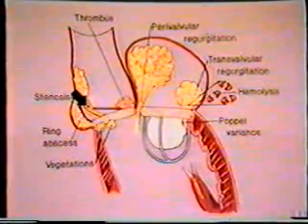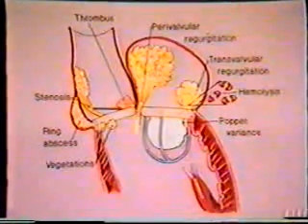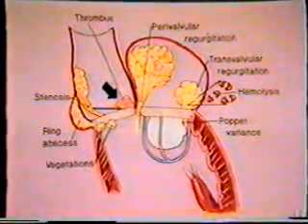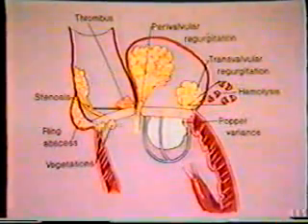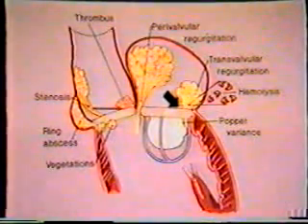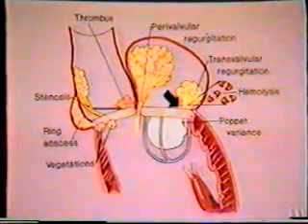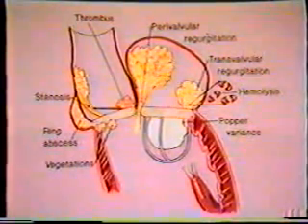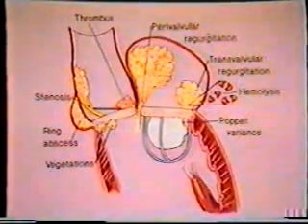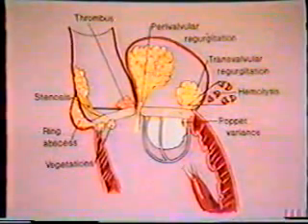Prosthetic valve stenosis can result from a prosthesis that is undersized relative to the patient, or can result from structural abnormalities such as thrombus formation or pannus ingrowth. Prosthetic regurgitation can be either perivalvular or transvalvular. This latter, for mechanical prostheses, can result from thrombus that prevents the poppet from seating properly, or from variance in the shape of the ball or disc. For bioprostheses, transvalvular regurgitation usually results from leaflet degeneration.